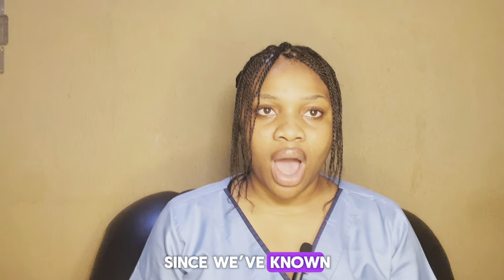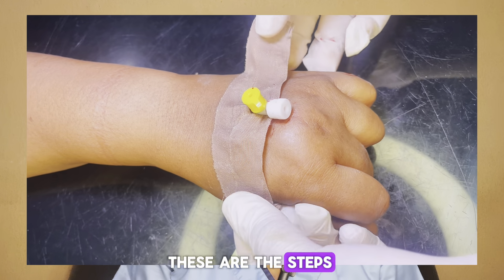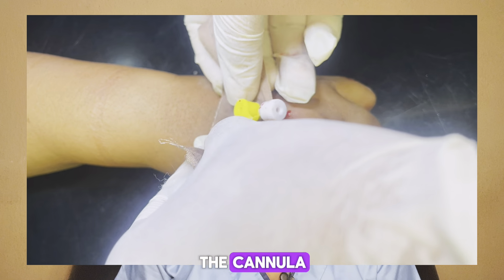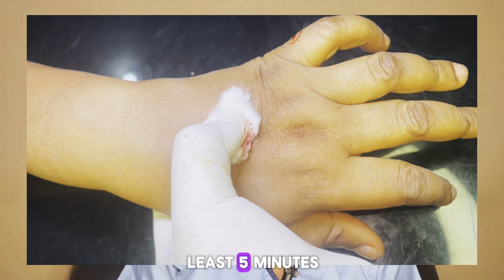Since you know how to insert the cannula, you need to know the removal too. These are the steps that are taken. You release the tape, you withdraw the cannula, then you apply direct pressure with a dry swab or gauze for at least 5 minutes.